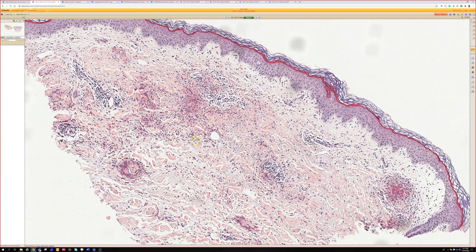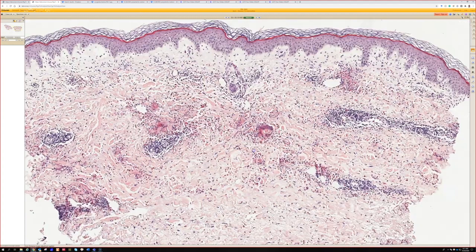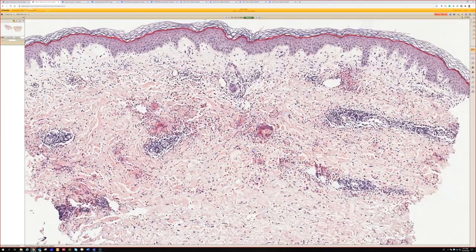You can also see some similarities of flame figure-ish type things in Churg-Strauss sometimes. So this is a really nice example of Wells syndrome and flame figures.